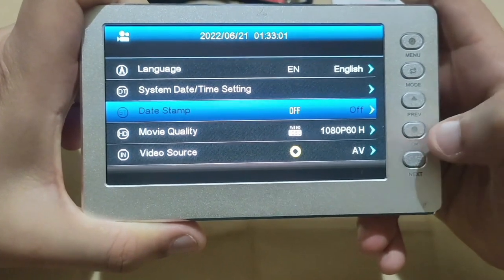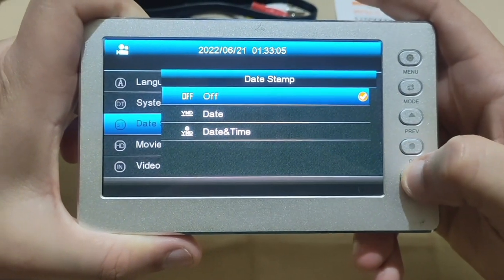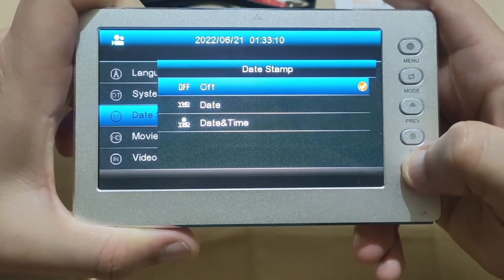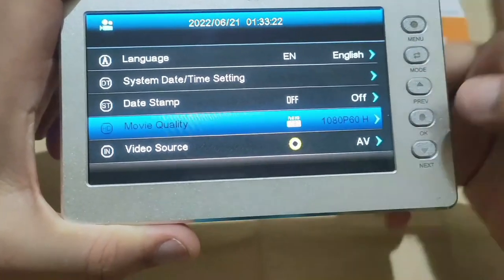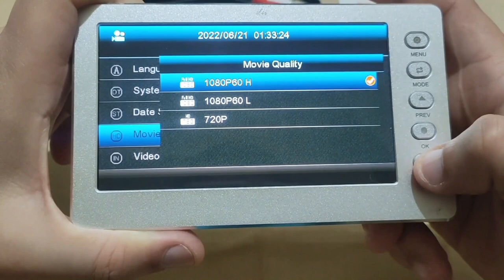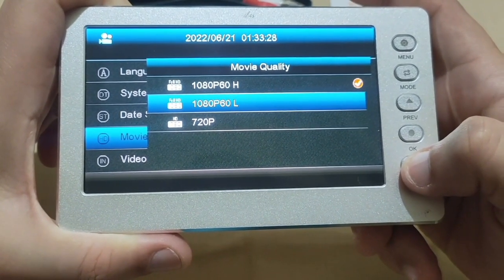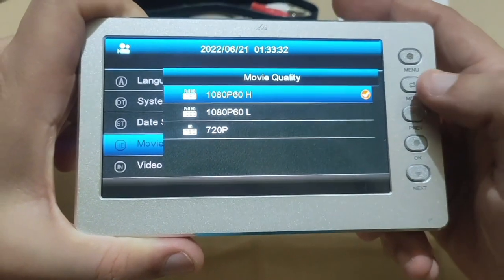To change the date stamp, go to date stamp and set the date stamp to off, date, or date and time. To change the quality of the recorded video, go to movie quality and change the quality to either 1080p 60 high, 1080p 60 low, or 720p.